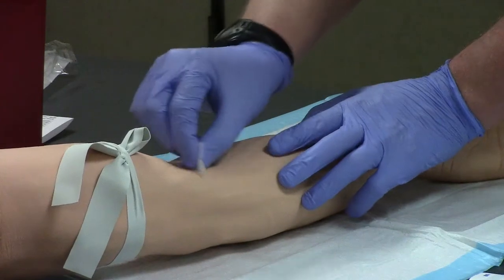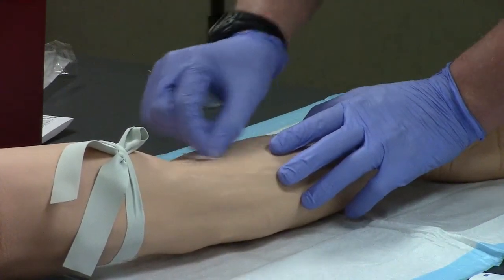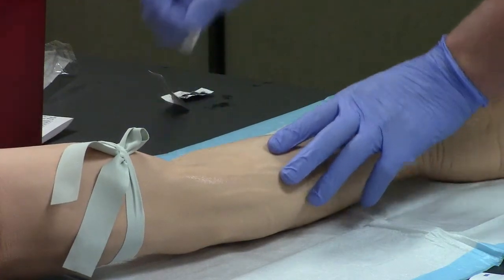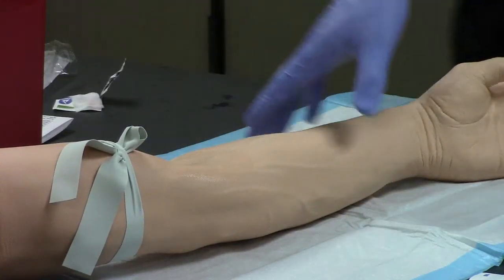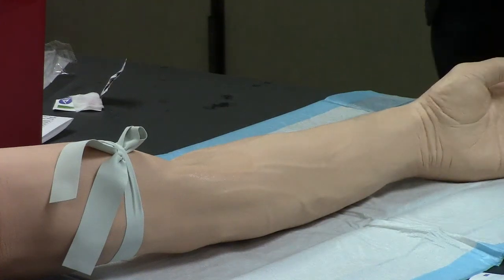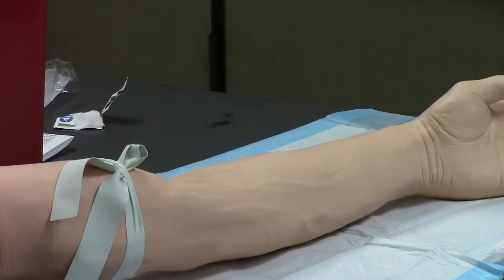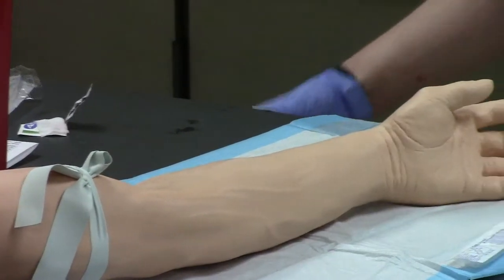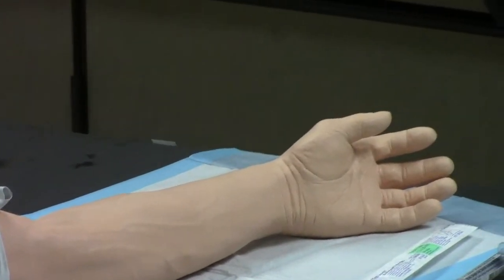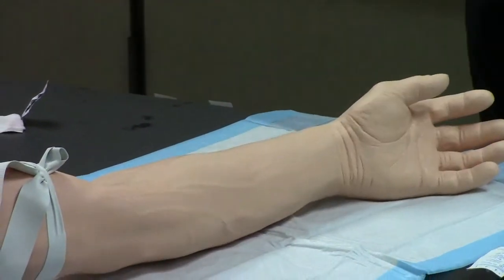When cleaning with our alcohol prep pad, we're going to use aseptic technique — making circles going from smaller to larger, working our way out, and then making sure not to touch the area. We want to give the alcohol just a moment to dry so it's not going to cause any discomfort. While I wait for that to dry, I can go ahead and quickly cut a couple of pieces of tape — three to four inches is plenty — and now it's dry and ready to go.